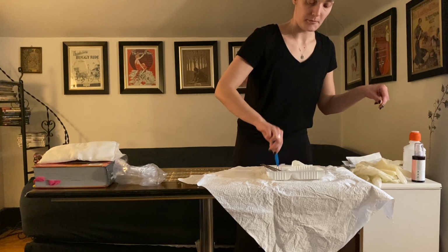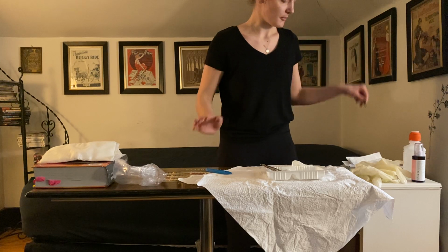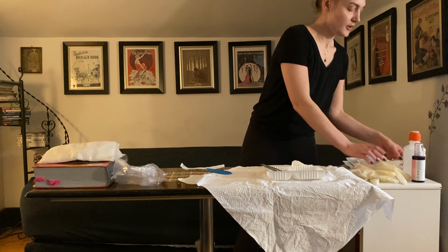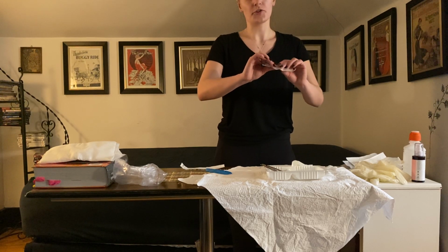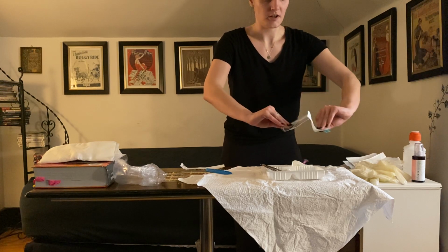And again, just always being mindful of my 1-inch borders. Okay, so now I'm going to start adding to my field. I'm going to set up my ruler here. So I have a 20 gauge cath on here. I'm just going to drop it in just because the packaging's been opened a billion times, so it's a little hard to work with. But there would also normally be a needle attached, which I would need to retract later on, but just dropping that in.